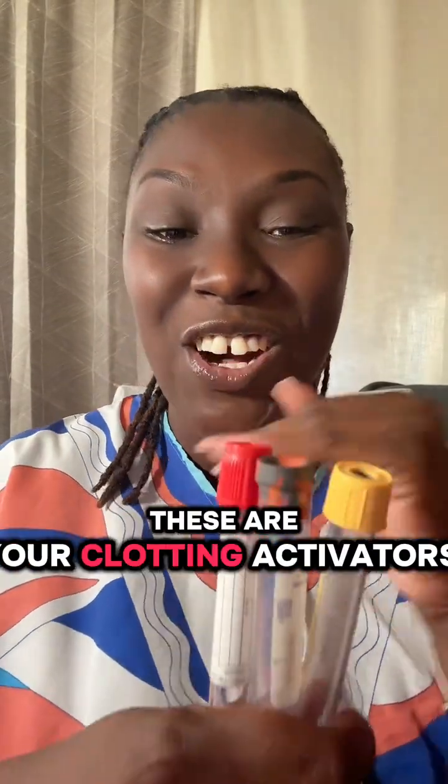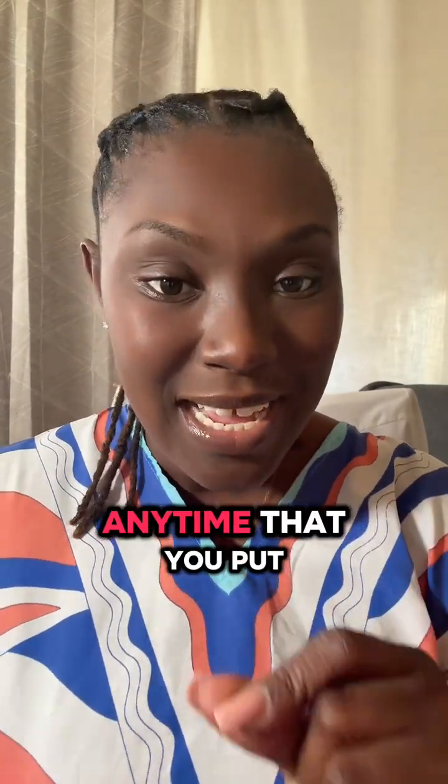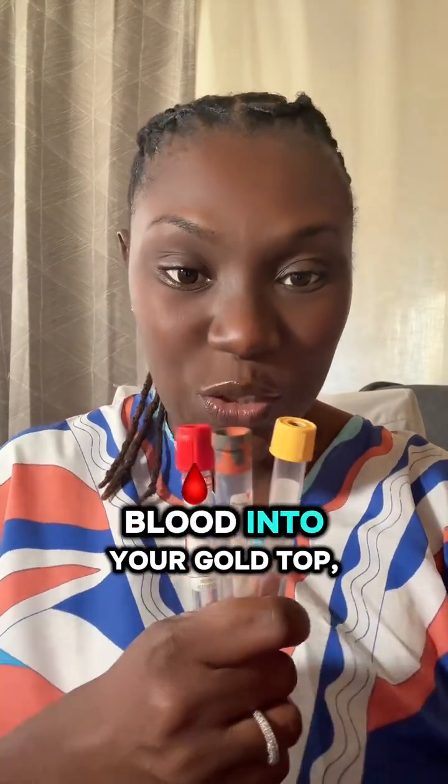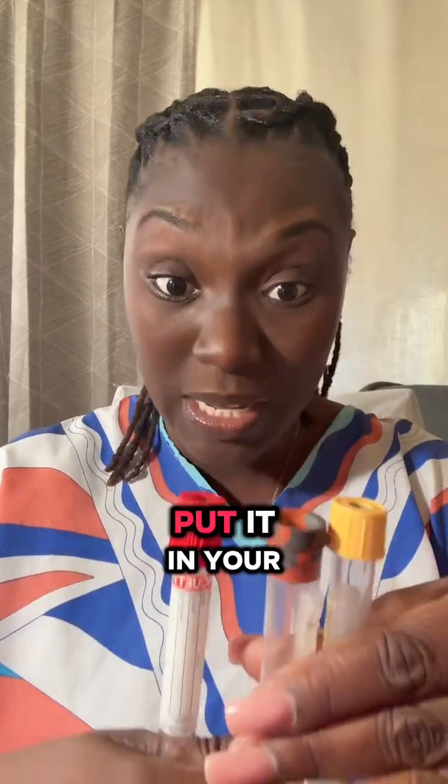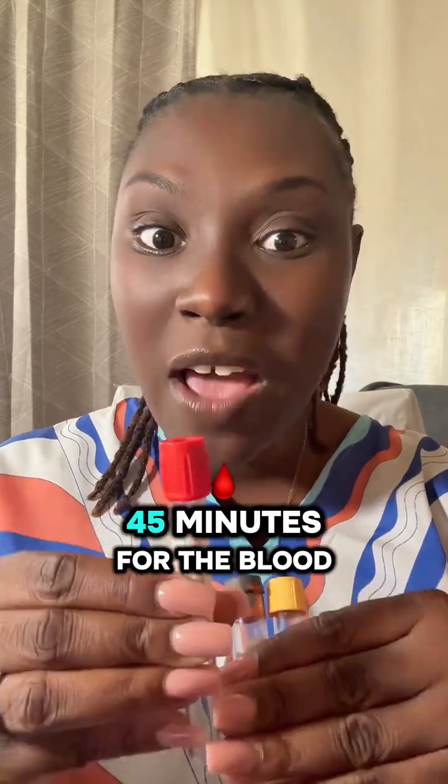Let's talk about our next set of tubes. These are your clotting activators. Now, what does that mean? Anytime that you put blood into your gold top, your tiger, or your red, you need to wait, put it in your bin or put it in your tray, wait for it to clot for at least 30 minutes. That's these tubes here, the one with the gel. And then for your red top, you'll wait at least 45 minutes for the blood to clot.